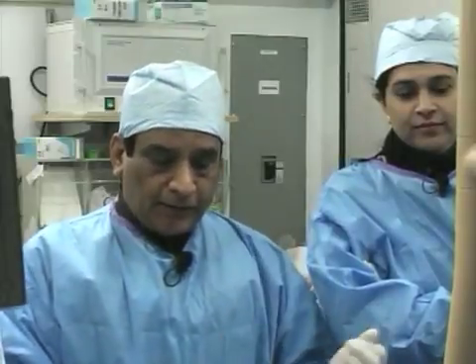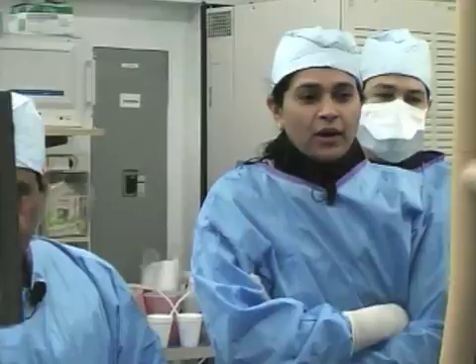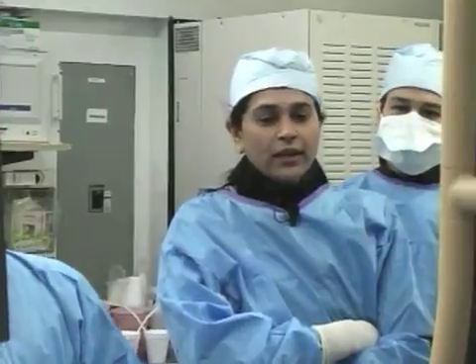And with that note, I just ask my co-director of the live web series, Dr. Keeney, to make some comment, and then we'll start the live case number 1 of this new series, which we have been doing for the last 14 months so far. Good morning, everybody, and welcome to this new series of live cases. Our goal would be moderate to complex cases. We will show step by step all the technical steps so that even a complex case can be performed safely in day-to-day practice of interventional cardiology.